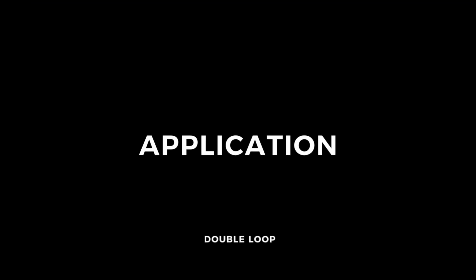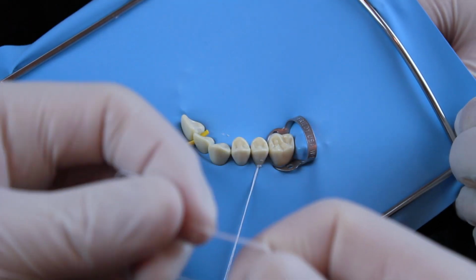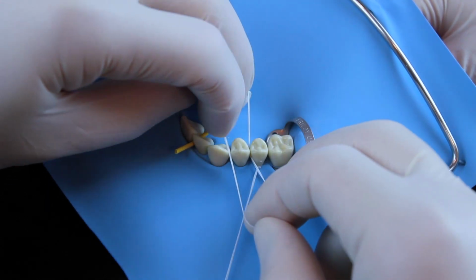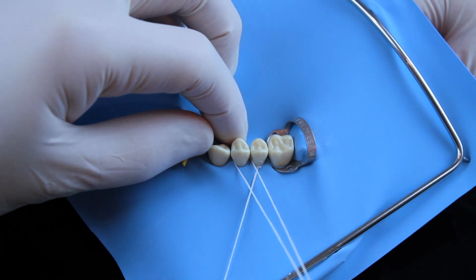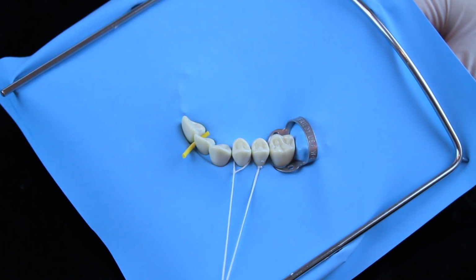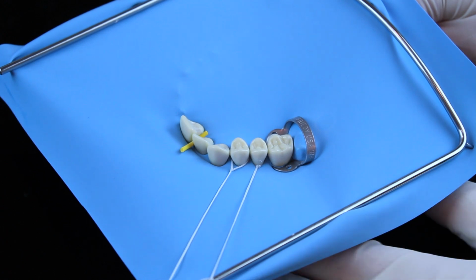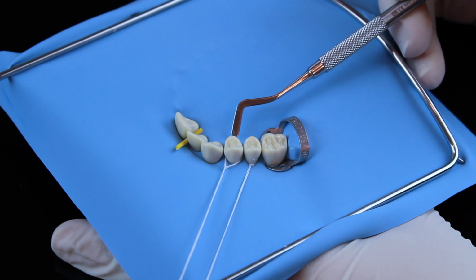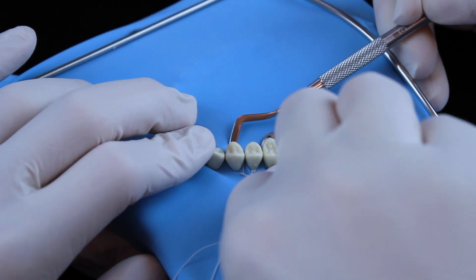The double loop is basically the same, but you can tighten it with one hand. A longer loop will help you get through the contacts more easily. Again, a flat instrument helps the floss to go as low as possible.